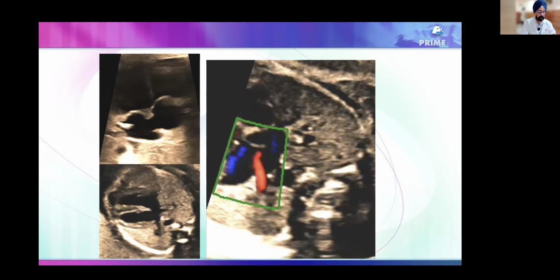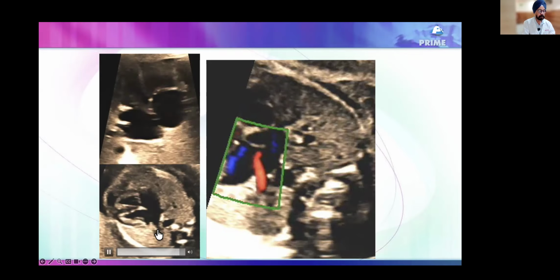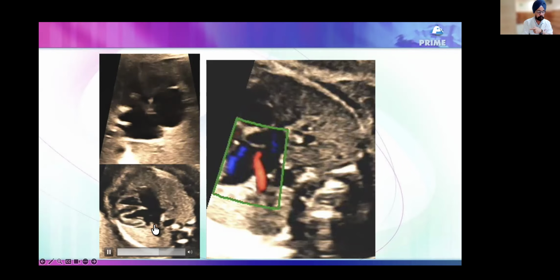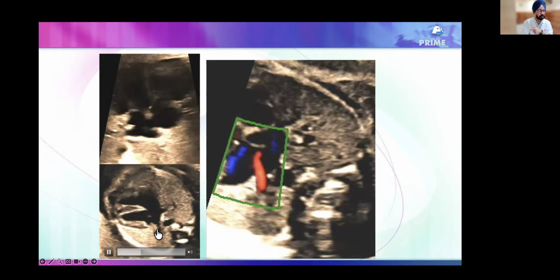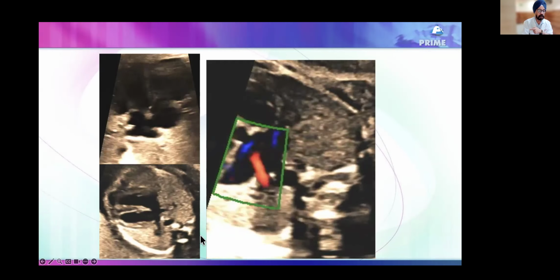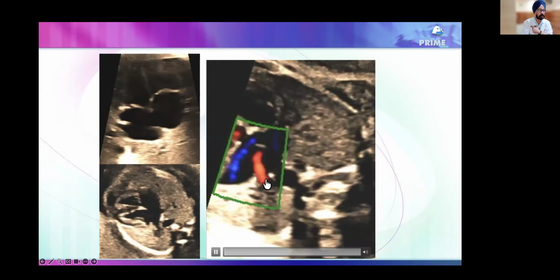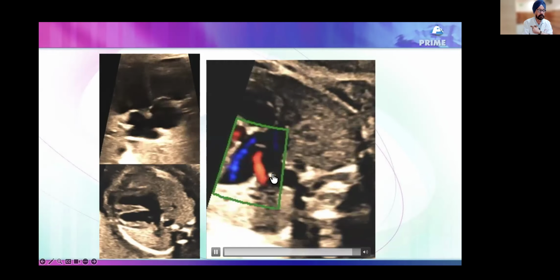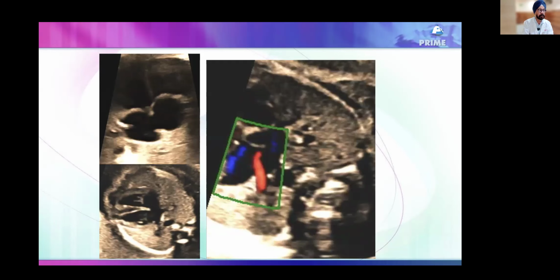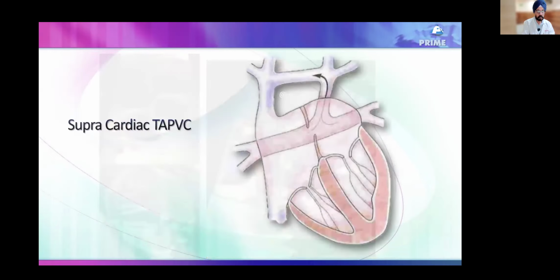So that's the Coumadin ridge. This you saw today. Exactly the lateral view. You saw the atrial appendage, and you saw the pulmonary vein, and you saw the ridge in between. And you can confirm this is the pulmonary vein, and that's the ridge, and that is the left atrial appendage, which is not showing any significant amount of flow to and fro.